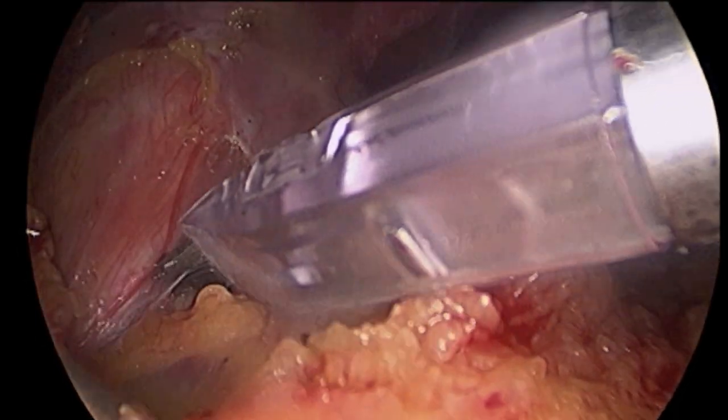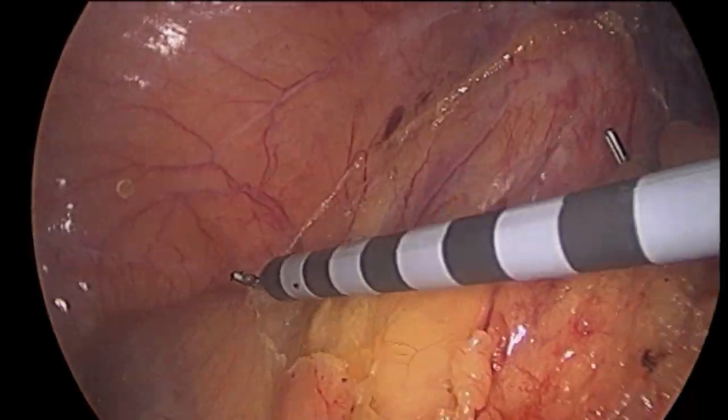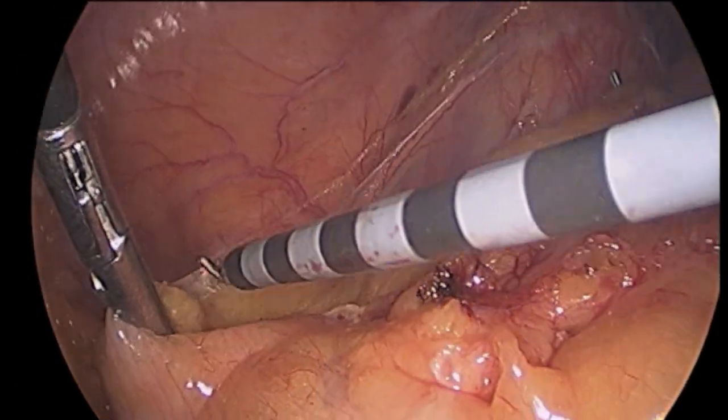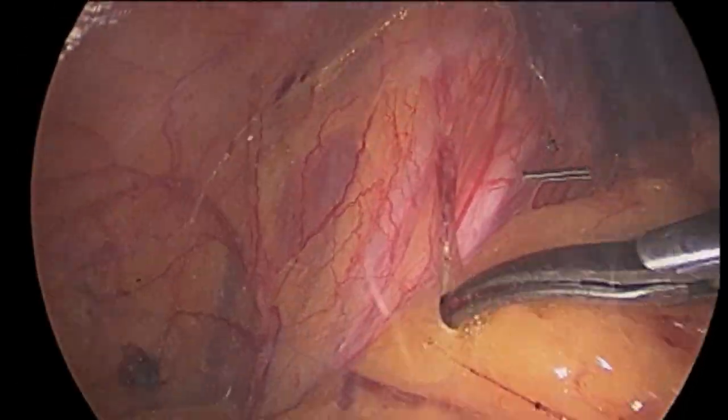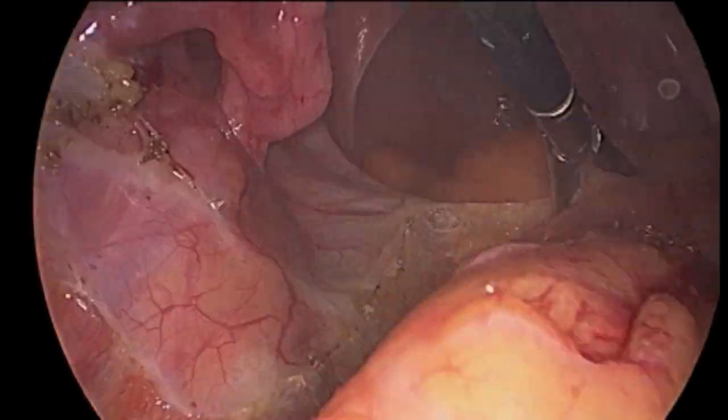Under general anesthesia, using a camera lens and two instruments, the lower colon or sigmoid is carefully dissected free. The left ureter, which carries urine from the kidney to the bladder, is identified and marked to avoid injury.